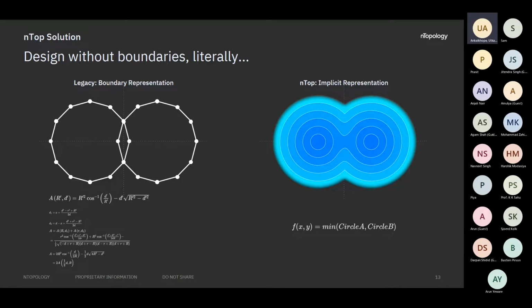The problem becomes more difficult when you move into multi-geometry modeling. So you have to bring two parts together or boolean them together. The equation becomes more complex, and the moment you try to give a fillet in this area or do a subtraction boolean, then you'll see it doesn't work fine every time. Many engineering and automotive industry people would relate to this when they do chassis level or body level modeling, when they convert files from CAD to manufacturing.